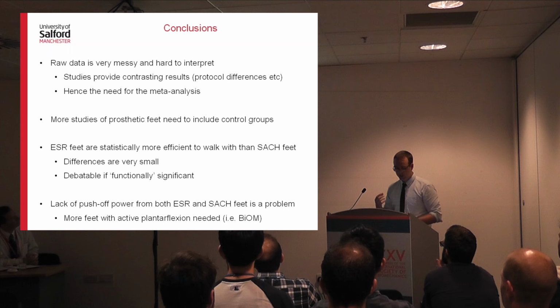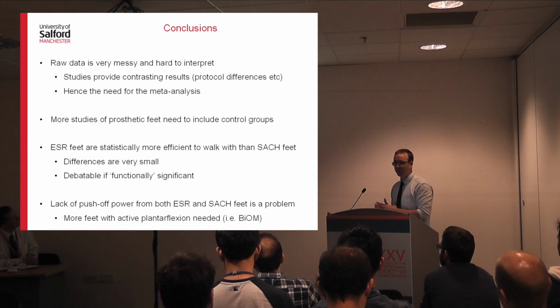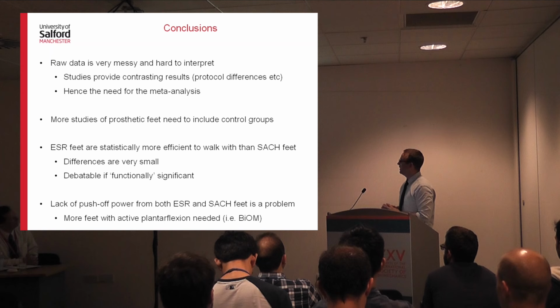Now, as you remember at the start, ESR stands for energy storage and return, and this idea that they improve the metabolic cost of transport, I think this is a bit of a misnomer, but it's kind of stuck in the literature now. They really don't do their intended performance. Even though they're supposed to store and return energy, they really aren't doing that. The differences that are there are very small, and it's debatable whether they are functionally significant differences.